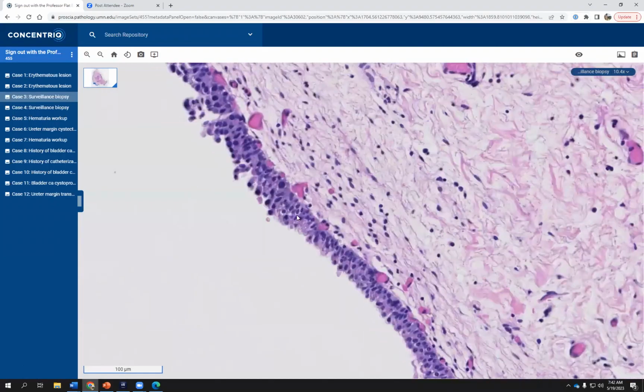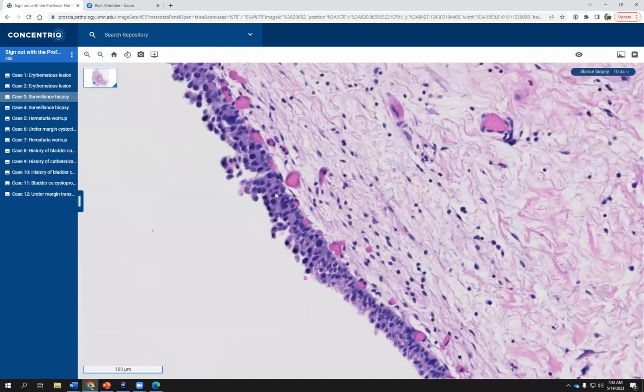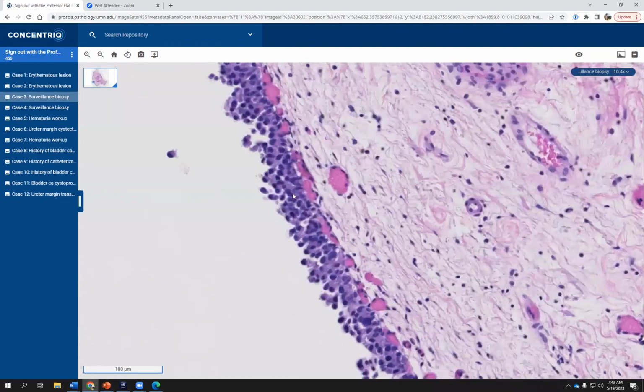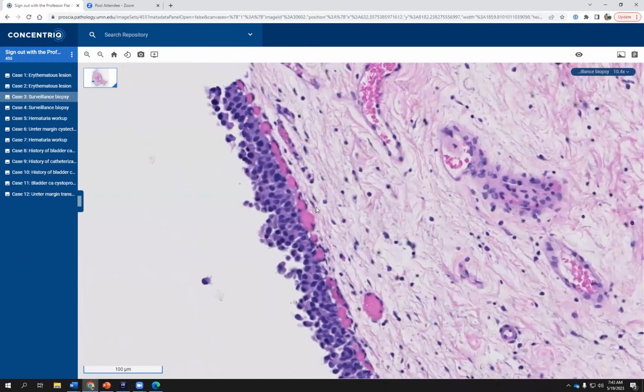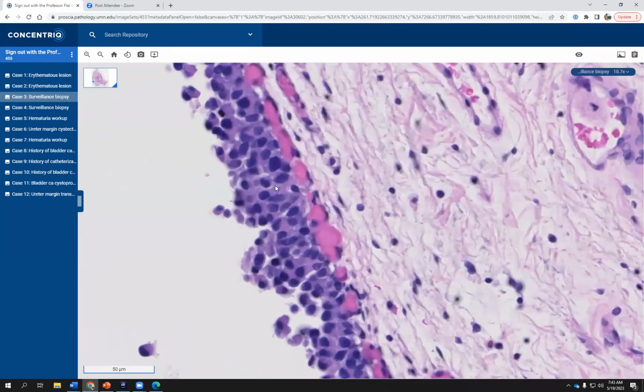But once you go across to the actual lesion, you can see a clear transition here in this area, where you can see the nuclei are getting more rounded. Even though the nuclear size may not be that large, you can see the nuclear shape is changing. And as you keep scrolling, you will see that there is overlapping of the nuclei. Again, as I mentioned earlier, you have this loss of polarity, and you have an abnormal nuclear membrane. It is irregular and not completely rounded.